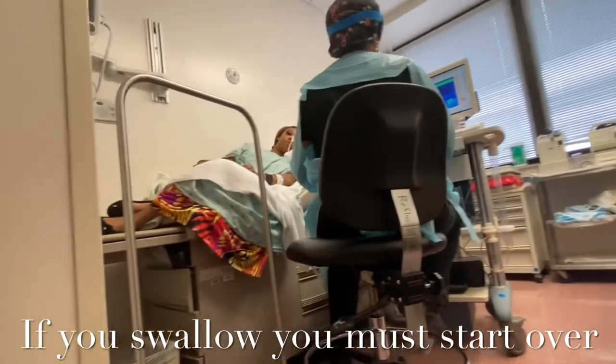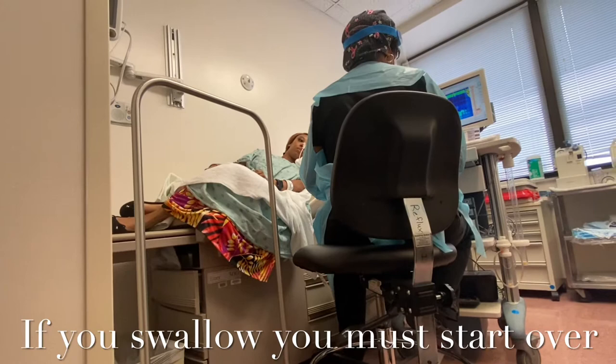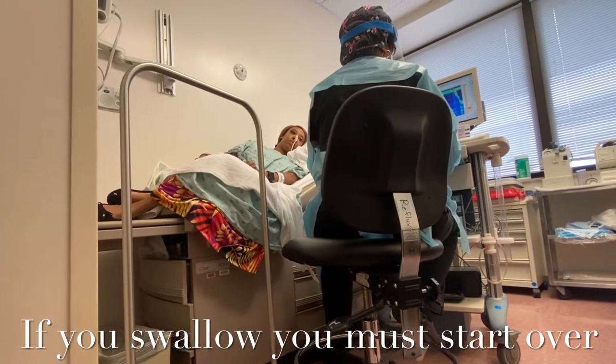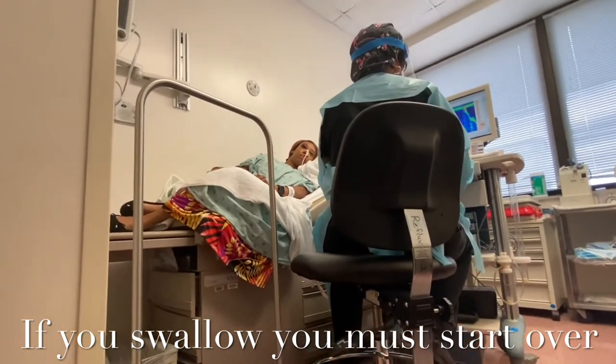Please don't swallow, don't clear, for 30 seconds.